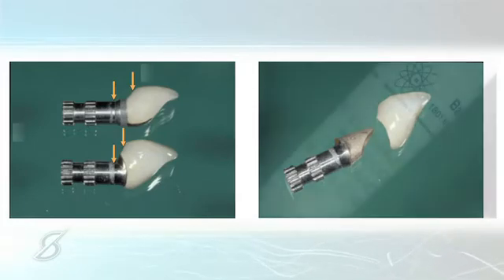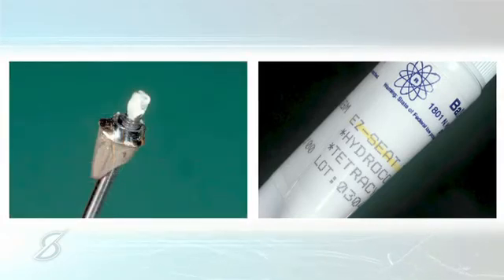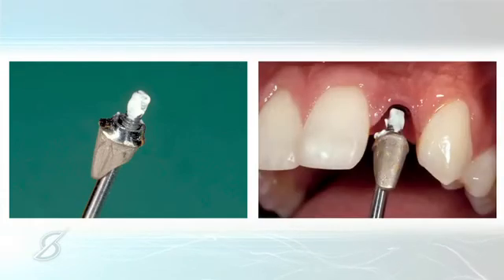Now, just as an aside, when I do seat abutments on implants, I actually add a little ointment that's a corticosteroid and tetracycline. It's called Easy Seat. And I just put a little drip of that. It's not a thread locker at all. It's actually an antibiotic and a steroid. Cuts inflammation down and kills bacteria. Just a little bit of it will then get expressed along the implant at the head of the fixture. So here it is being put to place.